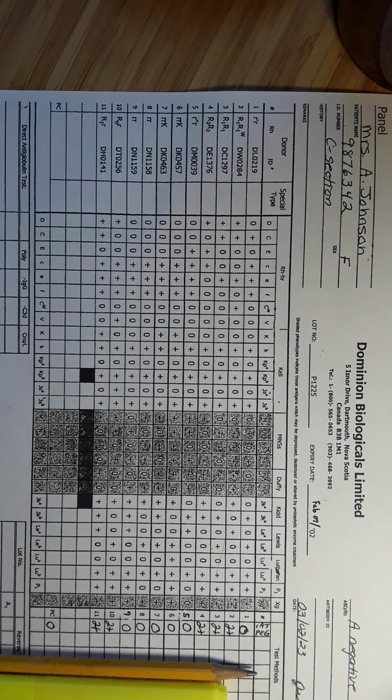So what we've got here, you guys, is a panel on Mrs. Johnson. Her ID and a bit of information is up on the top left-hand corner. She's a female that's in for a C-section. And over on the right-hand side, we can see that she's A negative. I'm assuming that this patient had a positive antibody screen, perhaps had a type and screen done prior to her C-section. And the screen came up positive, so they proceeded to do a panel.